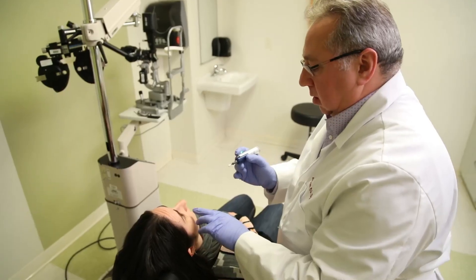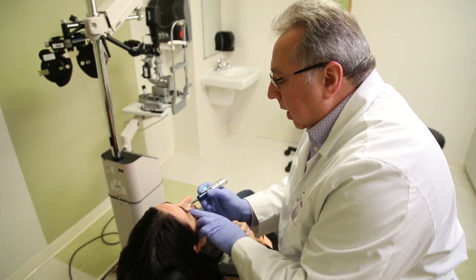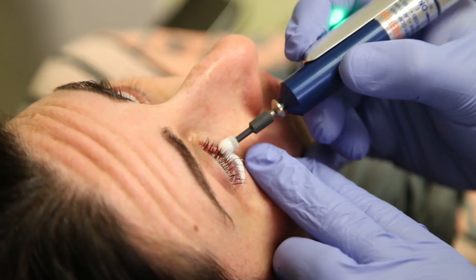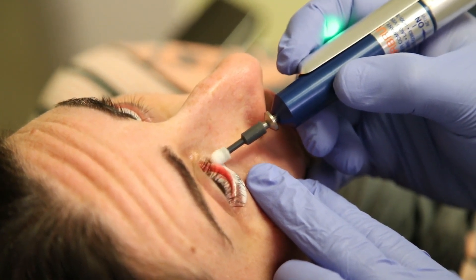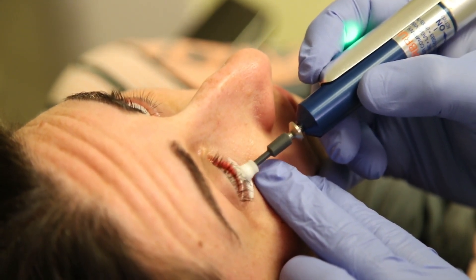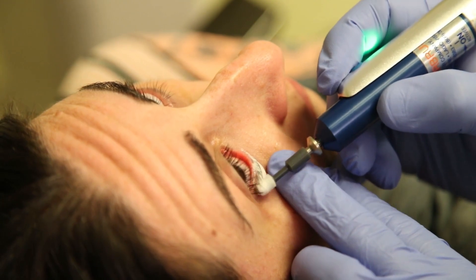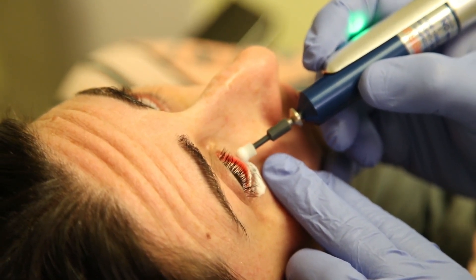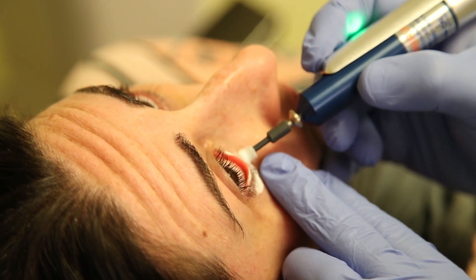Beginning with the right lower lid, ask the patient to look up, away from the rotating tip, and apply the tip to the outer lash line with firm pressure. Use your non-dominant hand to apply lateral pressure to the eyelid to keep it taut while treating. Move the tip back and forth, nasal to temporal and temporal to nasal, until you have cleaned the entire lid margin.